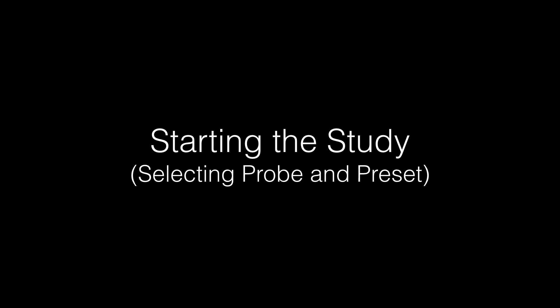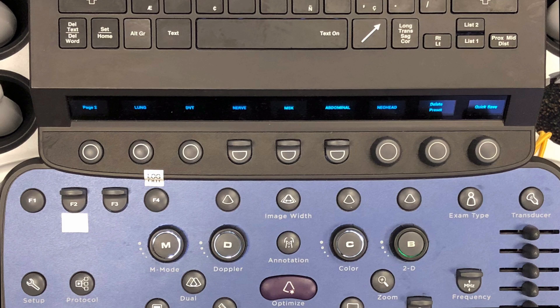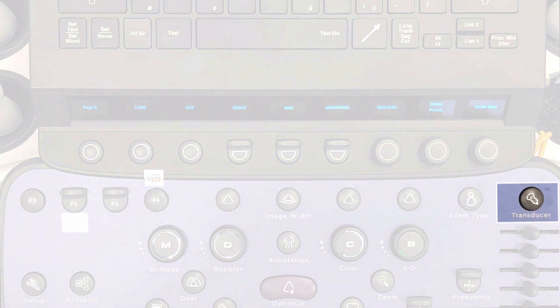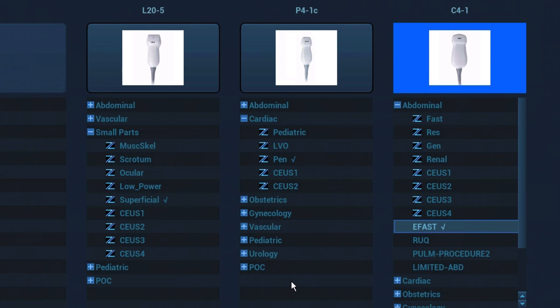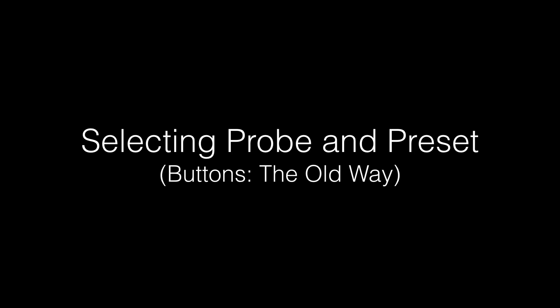Let's review how to select the probe and study type you want to use. The first step is to select the transducer you will be using — click the transducer button. On the screen, you will see all the currently attached probes and the different presets available for each probe. Use the trackball and the set key to choose the preset and probe you want to utilize. A close-up view shows the different presets you can select under each probe, divided by region or preset grouping. You can still select the probe and preset by the old method on the Xenari systems from software version 7 if that is your preference.